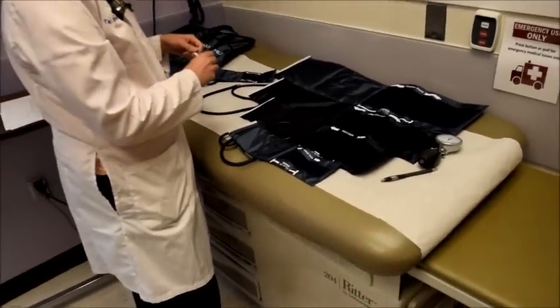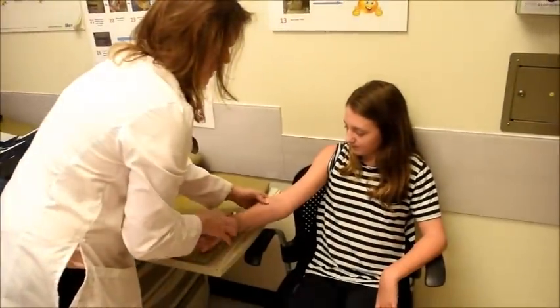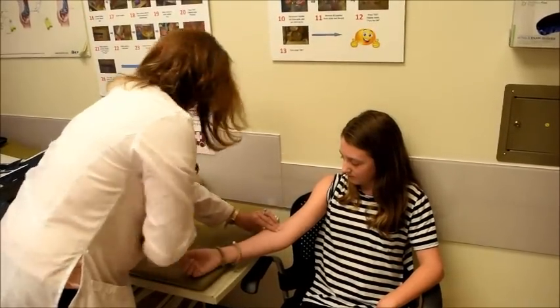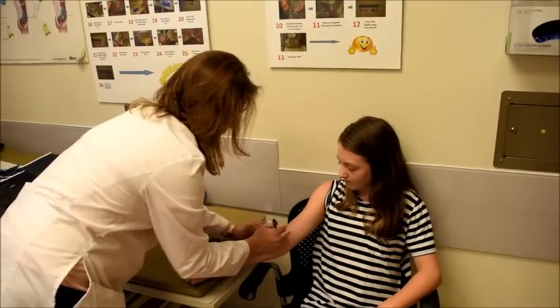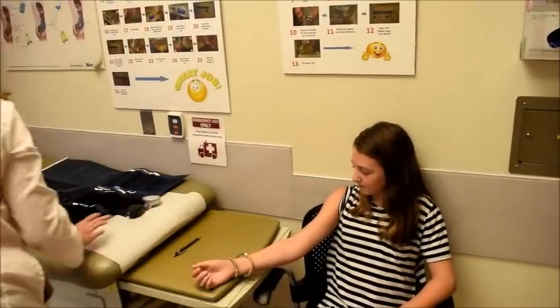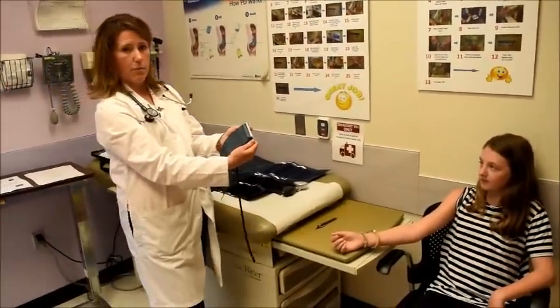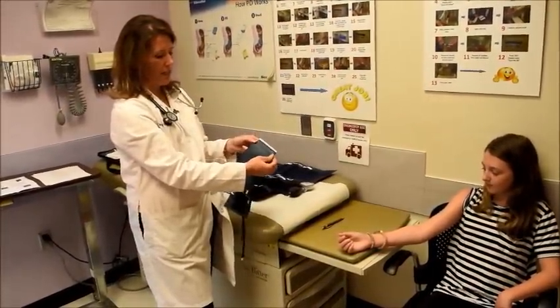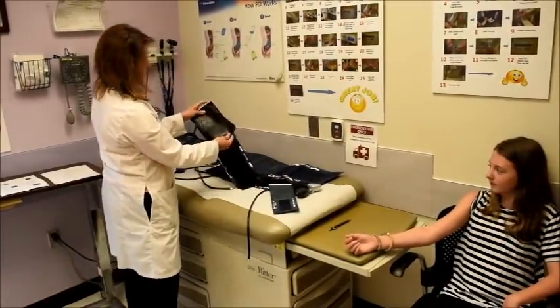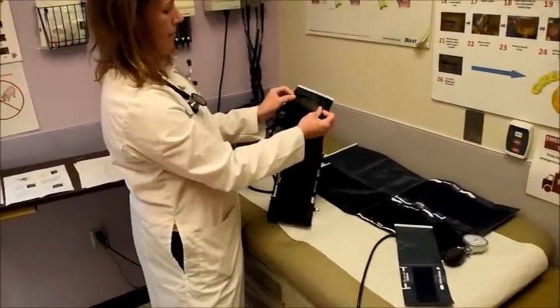centimeters. Then what you're going to want to do is palpate the brachial artery so that you know where you're going to center your bladder. Again, you're going to want to mark that. So then, when you take your cuff, you're going to want to feel inside for the bladder, because the bladder, as you'll see, is much smaller than the packaging. And I've demonstrated that here with the adult cuff. This is the bladder, and you'll see that it is, in fact, much smaller than the packaging.